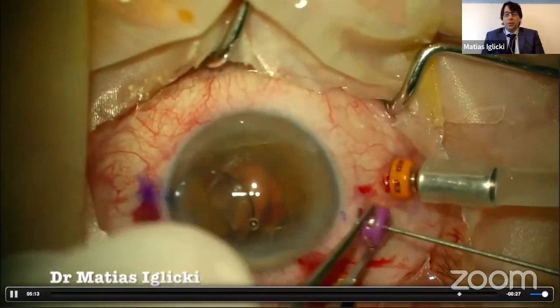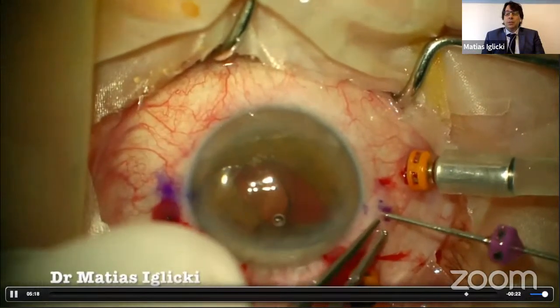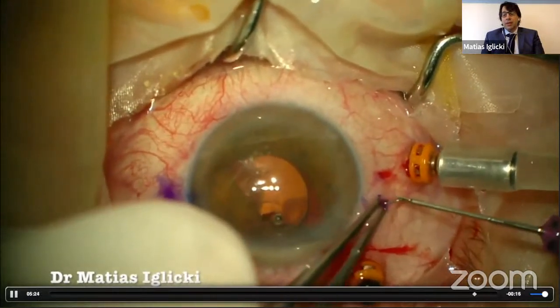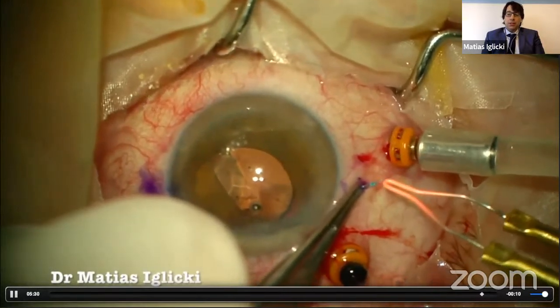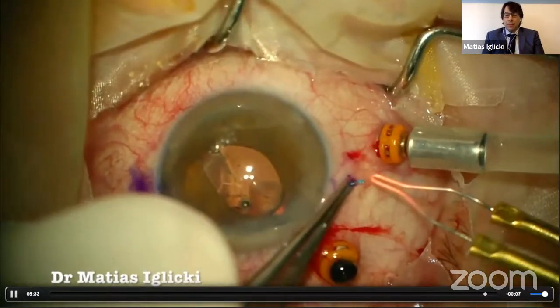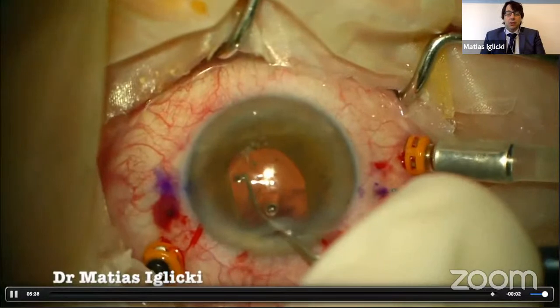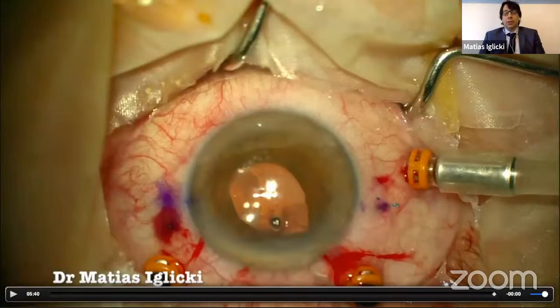and Catharina will show. But if we compare with the technique that we had been using before, which is to insert a 27 gauge trocar and then take the haptic from there, the wound is much bigger, and we stopped using this technique because we have to make a bigger button on that haptic in order for it to stay there. And we have been seeing a lot of dislocation. And you can see here how big it is on the right and how small it is on the left, because on the left we used the ultra thin wall needle, and on the right we used a 27 gauge needle. So this is what we have.